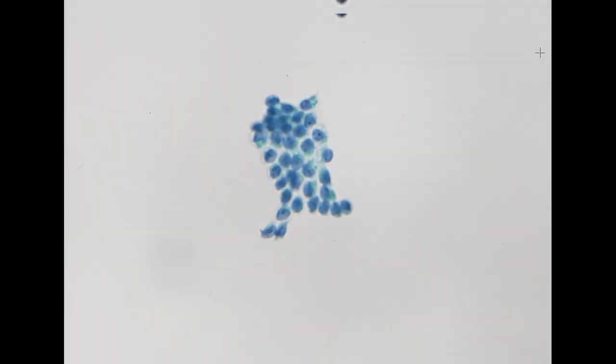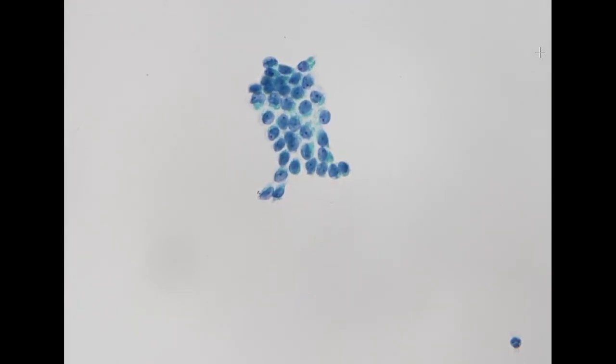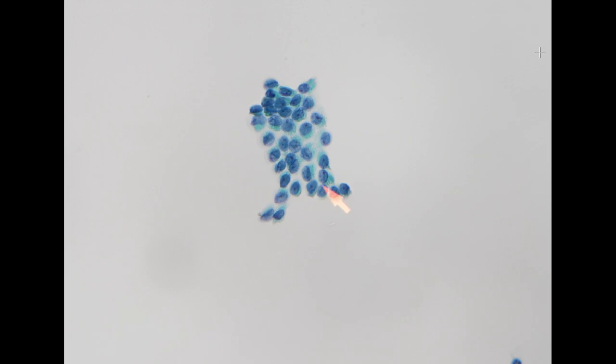However, if you go to high power, these follicular cells indeed demonstrate some nuclear features of PTC, which include the powdery ground glass type of chromatin pattern. The shape of the nucleus is a little bit elongated. There is some focal overlapping. The nuclear contour is relatively irregular, and we do see quite frequent grooves within these cells. So each cell looks a little bit like a coffee bean.